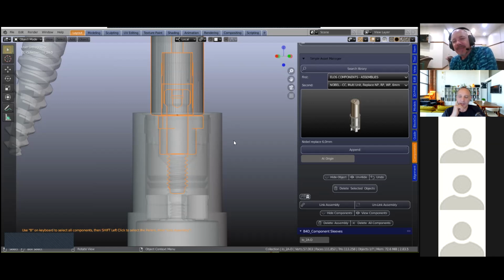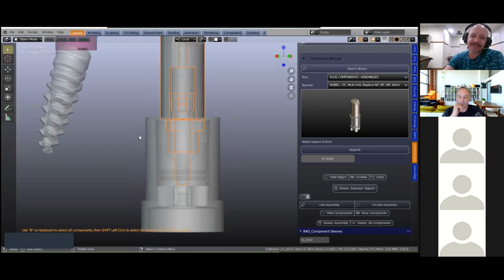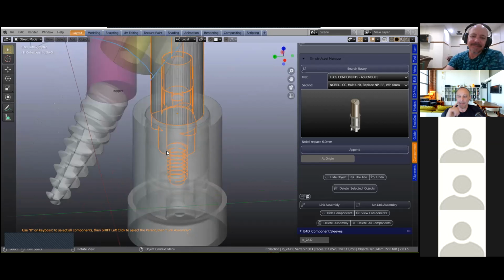Camlog is in the process as well, and we have many people approaching us, which is good, but it takes time. These libraries are made up of hundreds of components, and each one of them has to be compiled. So we're working 24/7 on this, and I understand the urgency. The urgency is there, and we're very grateful to people who are supporting us.